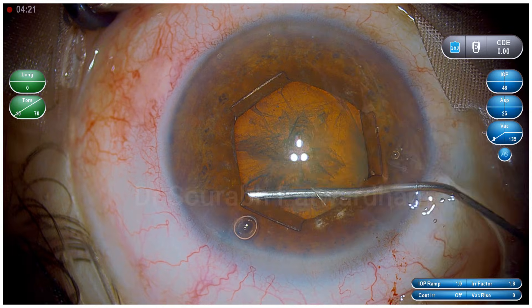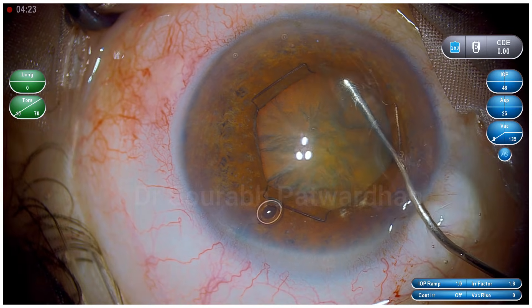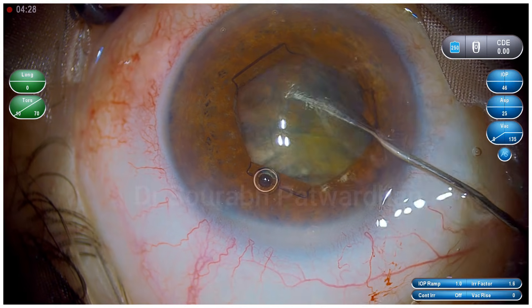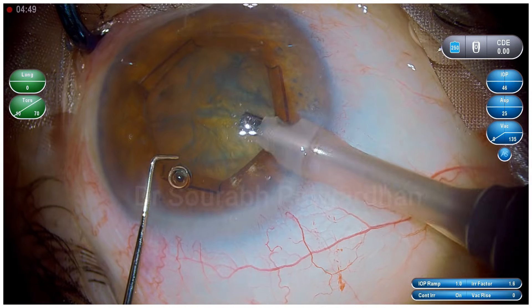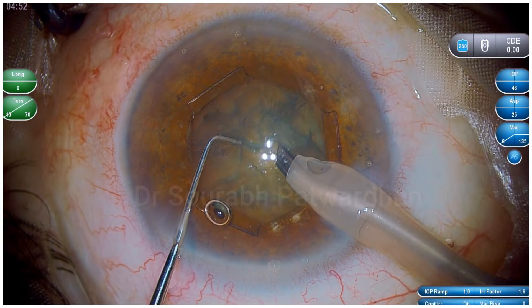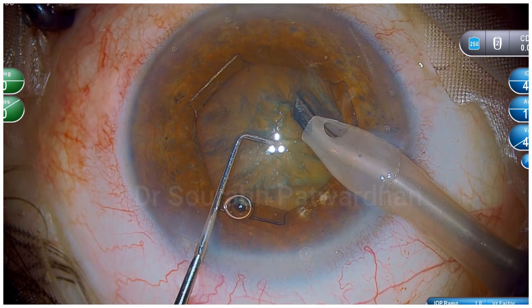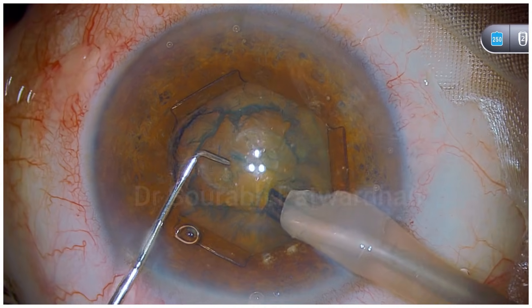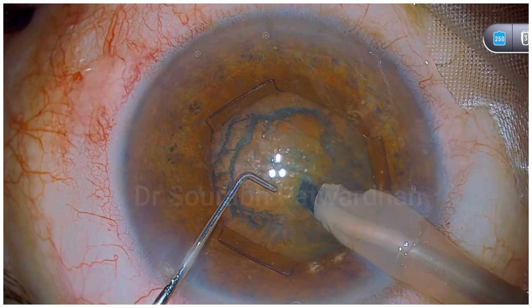This will retain the pupil size so that during surgery it doesn't come down. Watch the careful hydrodissection — I am making sure that while injecting the fluid it is minimal and in multiple quadrants so the iris doesn't prolapse. Using the Bhex ring will not prevent iris prolapse if you do overzealous hydrodissection.